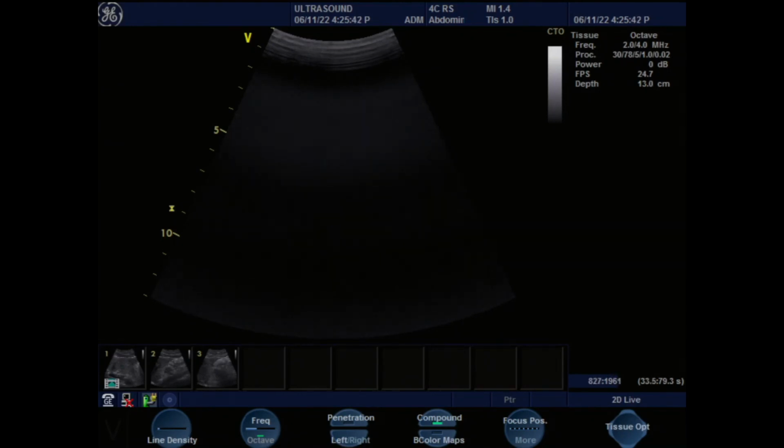Would you like to scan on somebody? No, you're okay. Okay. Anyone want to volunteer? Does anyone want to volunteer so I can try scanning? Okay, thanks, Ali. We've got a couple of minutes. So I have to take everything off? No, just. I knew it was risky asking. That's a typical question. Okay.